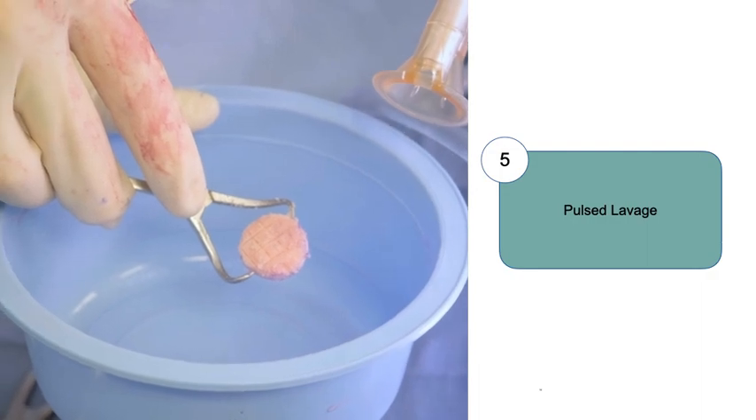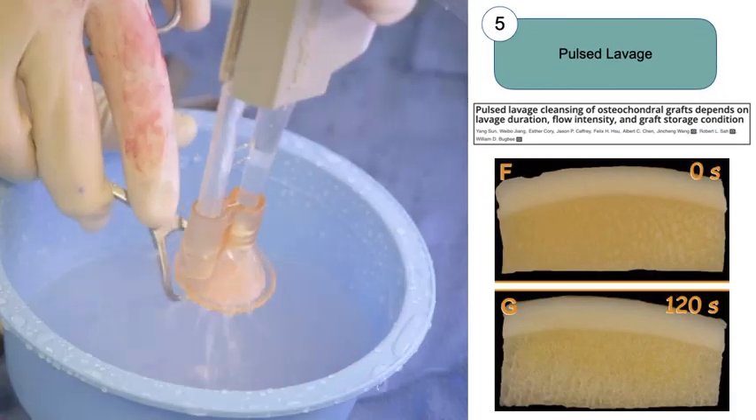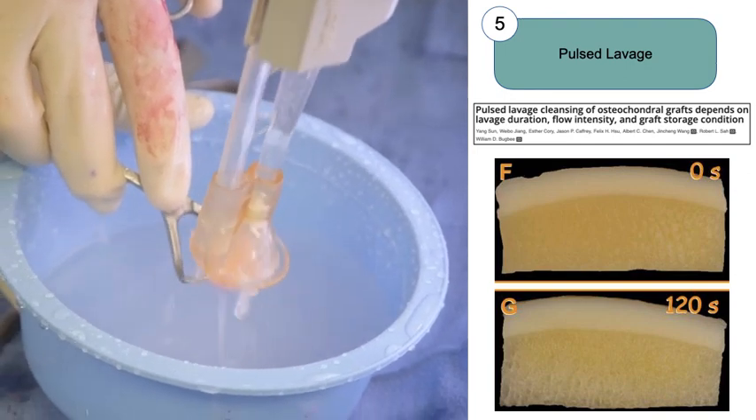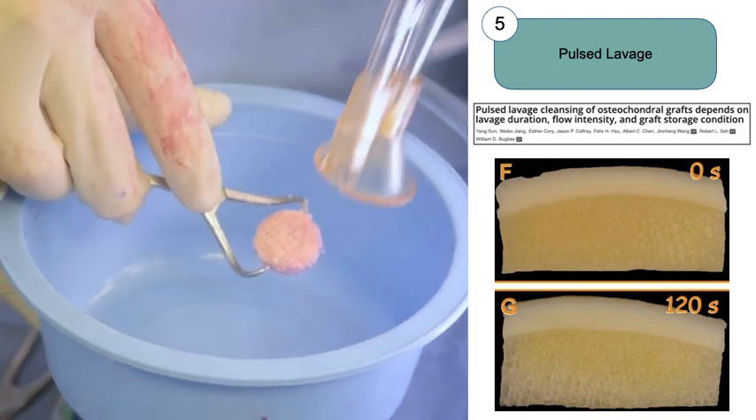The next step is to utilize high pressure pulse lavage with normal saline. When utilizing the pulse lavage, high flow increases the marrow space compared to standard flow, and research suggests that there is an ongoing reduction in marrow elements for up to two minutes of pulse lavage applied to the subchondral bone of fresh osteochondral allografts.